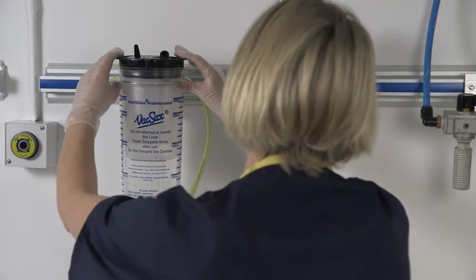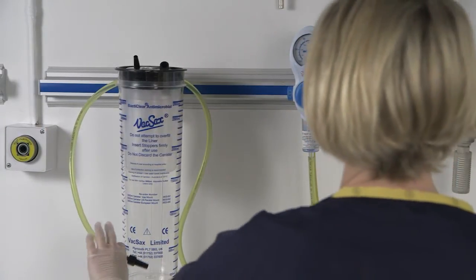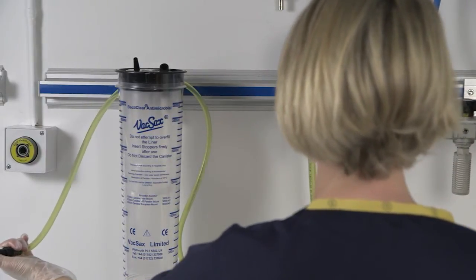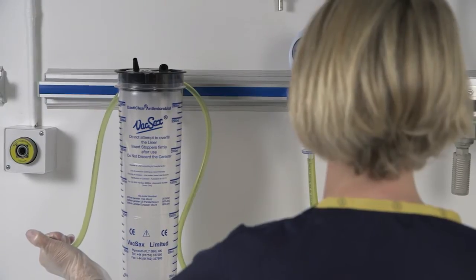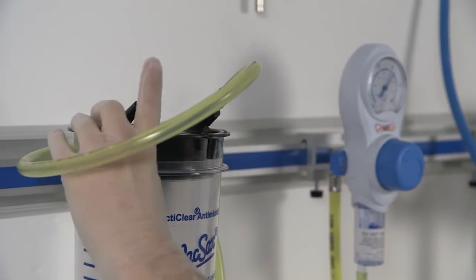To inflate the liner within the canister, turn on the vacuum to high and place your finger over the end of the tapered connector located at the end of the non-disposable yellow vacuum tubing. The liner inflates. Connect the black vacuum tapered connector into the vacuum port located on the liner lid.